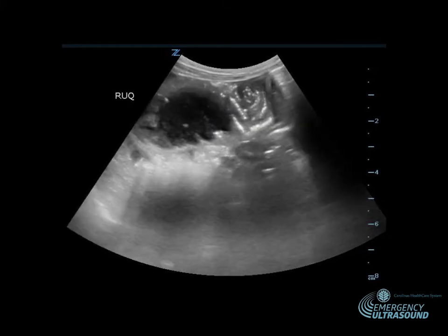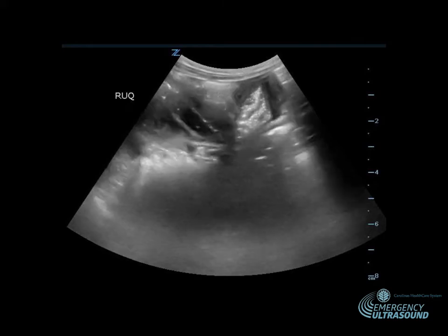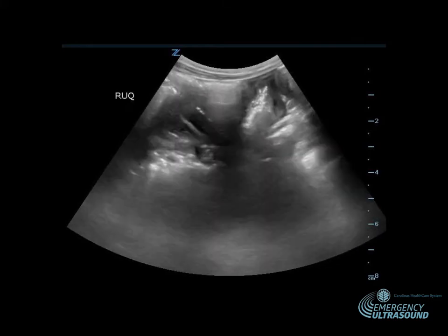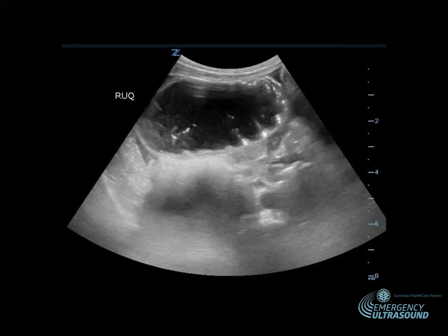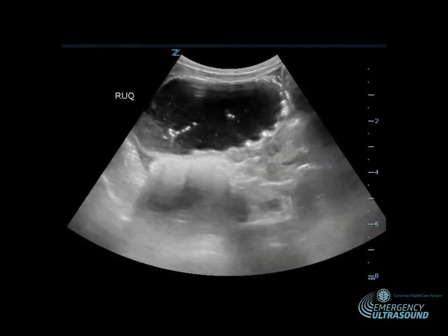What about right here? Look closely at this one. So we are seeing some hand movement of the ultrasound probe, from the outside just sweeping through, but on the top of the screen we're seeing a nice dilated loop of bowel.